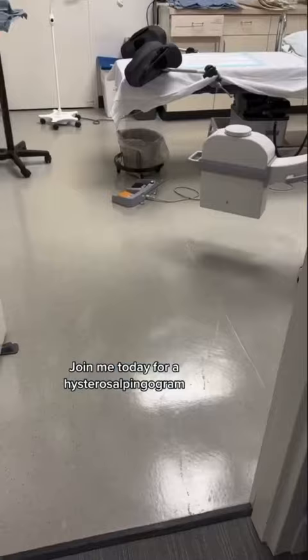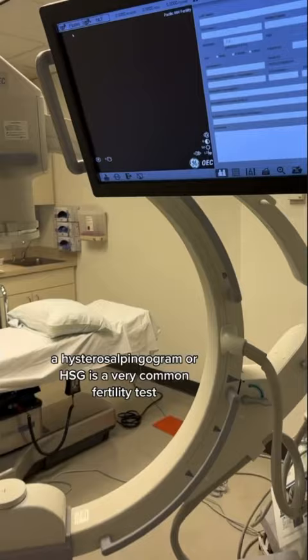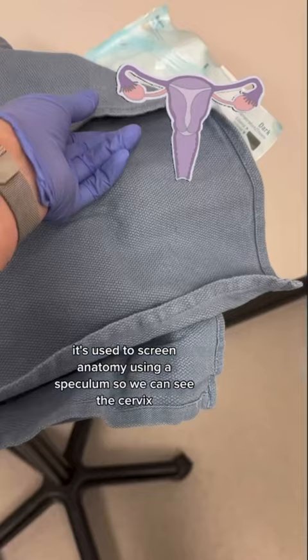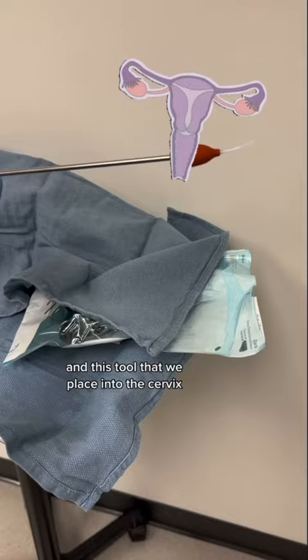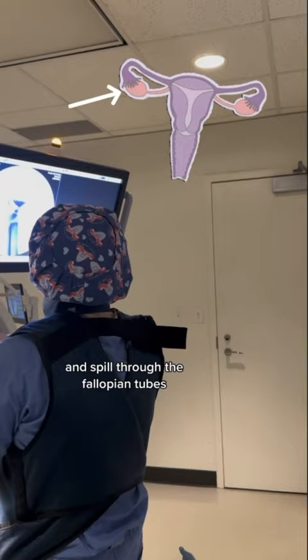Join me today for a hysterosalpingogram. A hysterosalpingogram, or HSG, is a very common fertility test. It's used to screen anatomy using a speculum so we can see the cervix, and this tool that we place into the cervix allows fluid to go through the cervix, into the uterine cavity, and spill through the fallopian tubes.